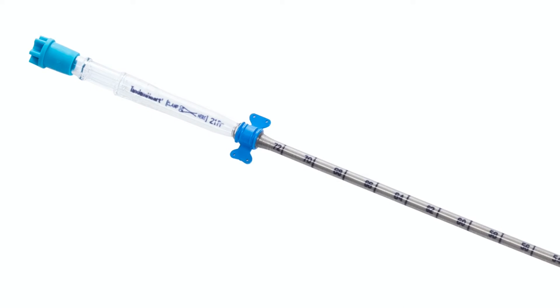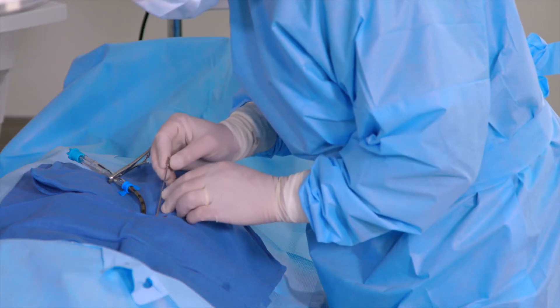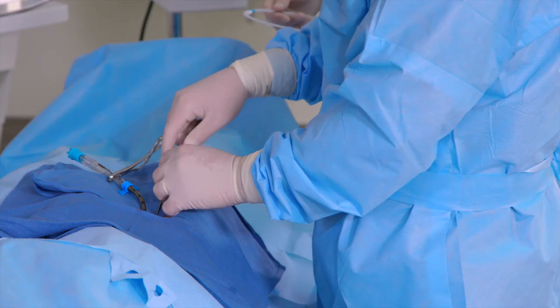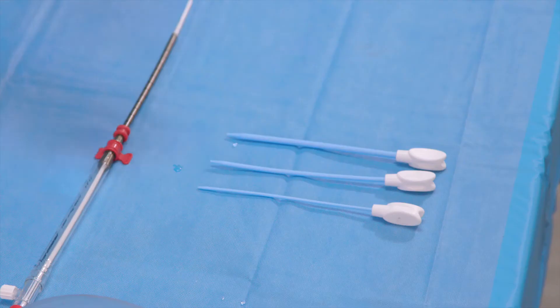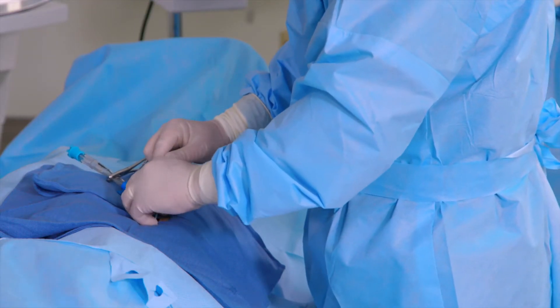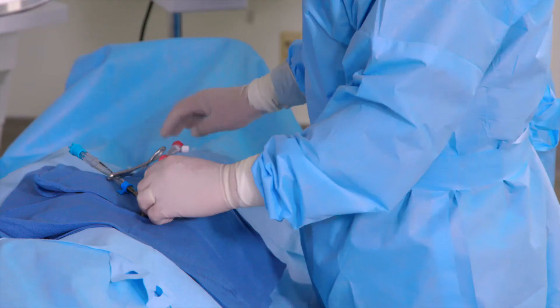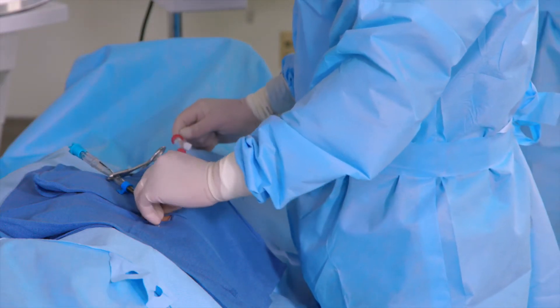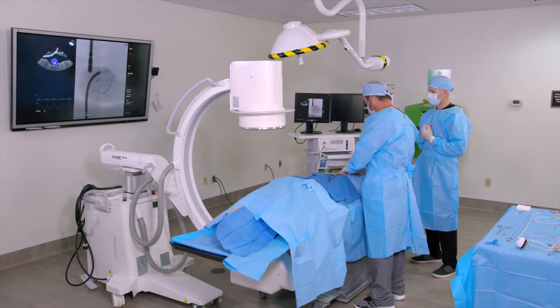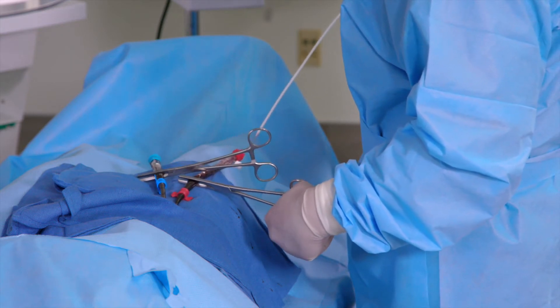Note the transeptal and arterial cannula depth markings. Using a percutaneous entry needle, gain arterial access in the femoral artery of choice. Serial dilate appropriately prior to placing the arterial cannula in the patient's femoral artery. Remove the wire and introducer and clamp the cannula.